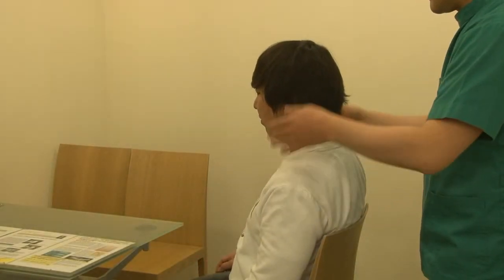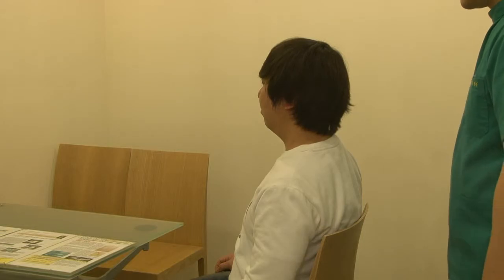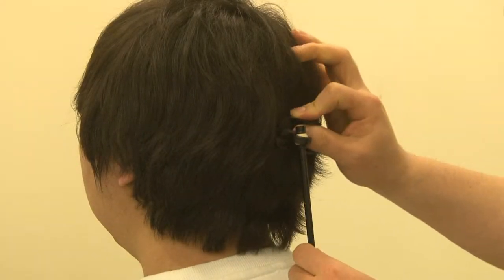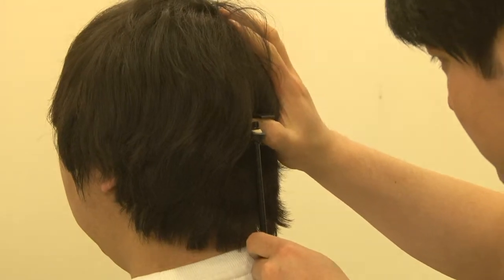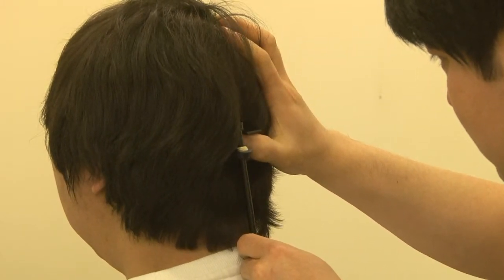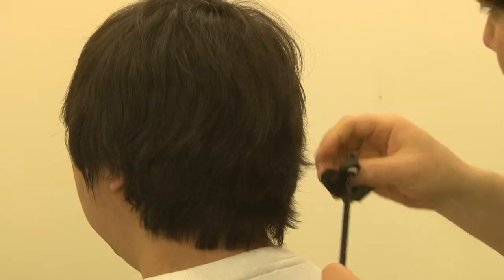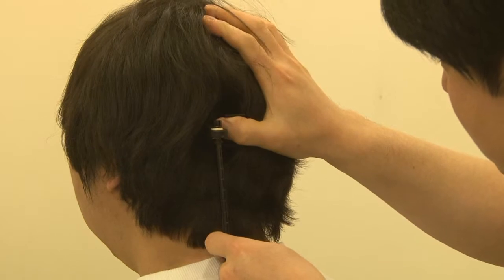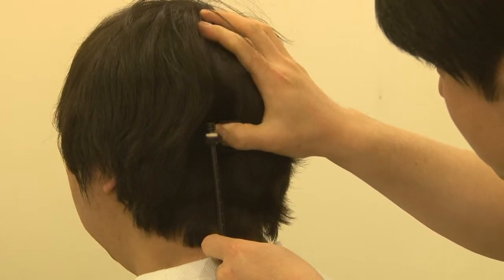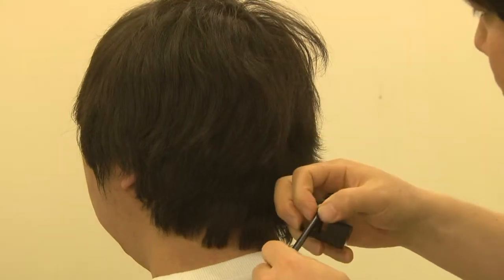First, straighten the patient's back and neck. The mobile part is held by pressing the operator's thumb over the scalp, and then moves the scalp up and down to measure the levels of scalp mobility. This procedure was repeated at the middle and both lateral posterior occipital areas, both mastoid and temporal areas, with five centimeter intervals.